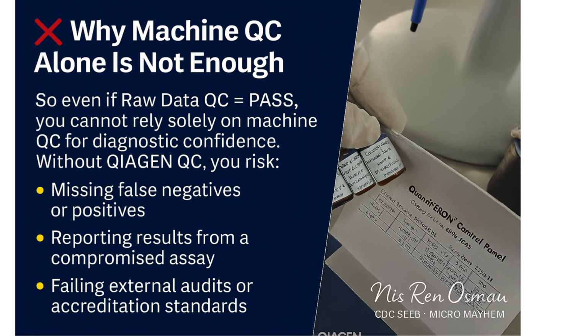In slide 13, why machine QC alone is not enough. Even if raw data QC passes, relying only on machine QC is risky. Without QIAGEN QC, you could miss false results, report compromised assays, or fail external audits if an inspector comes.